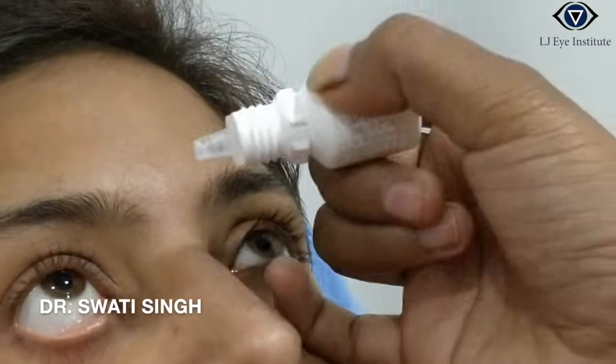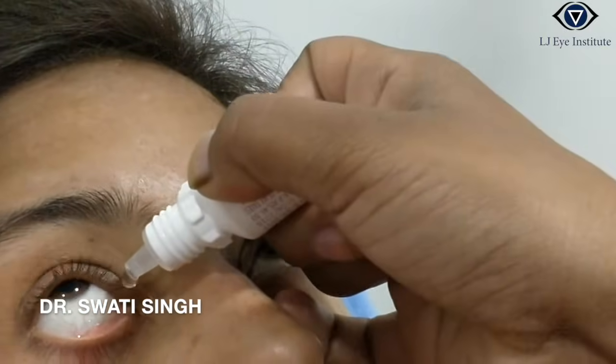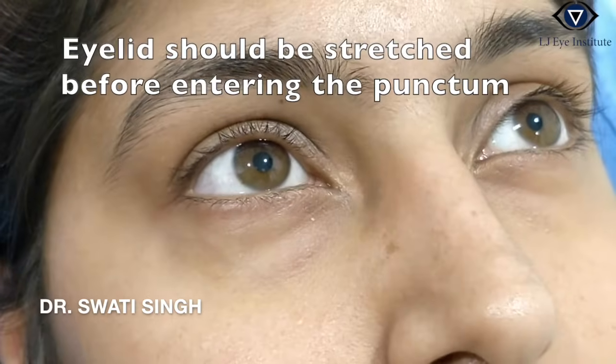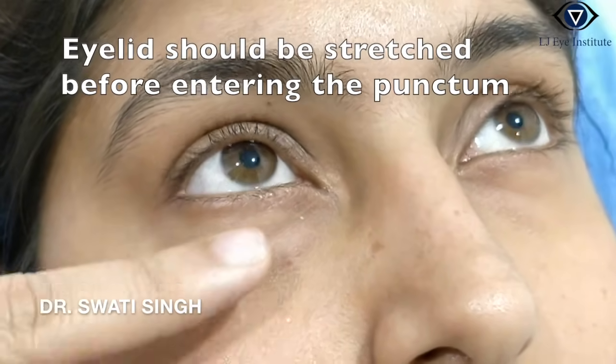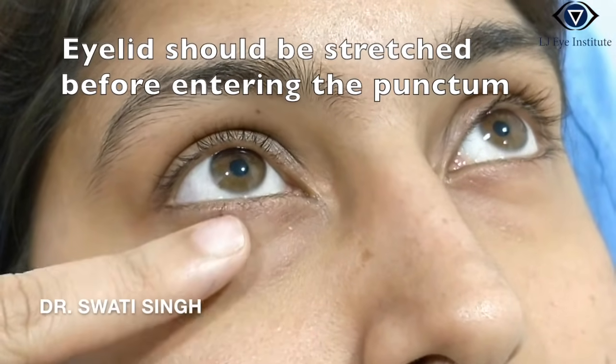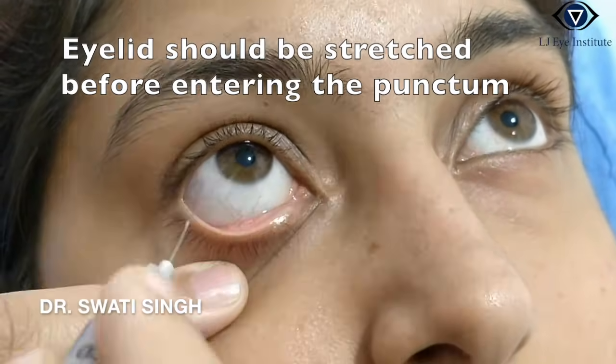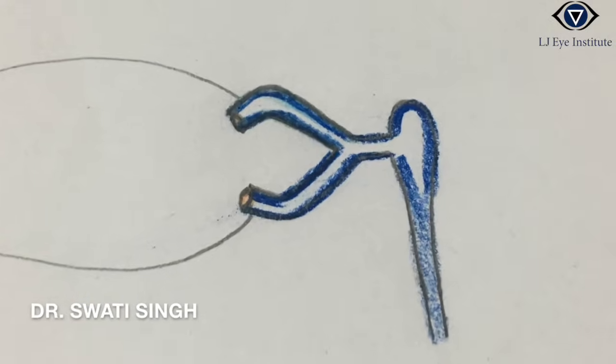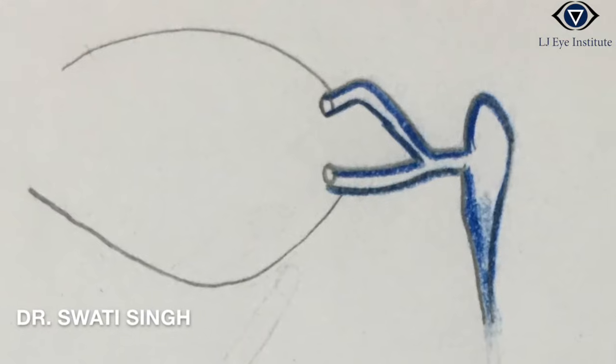The patient is positioned in a semi-reclining state and topical anesthetic drops are instilled. The lower eyelid is gently pulled downwards and outwards for everting the lacrimal punctum and straightening the horizontal canaliculus.